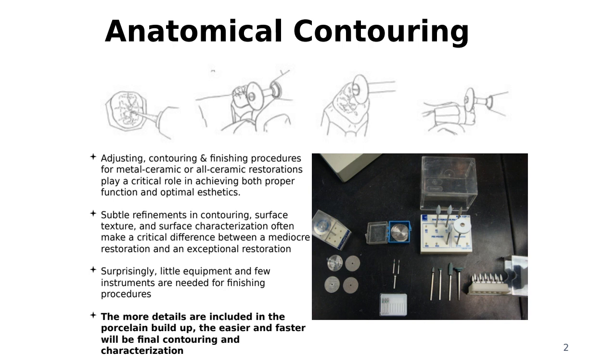There you go. So there is no difference between natural teeth and what we did. But if it's for anatomical contouring, is that before or after we apply? So this is after we apply the build-up of the porcelain, and then when we build up the boundaries. Anatomical contouring can be done, and that's a good question. Either during your build-up, right? So when we built up the porcelain, right?